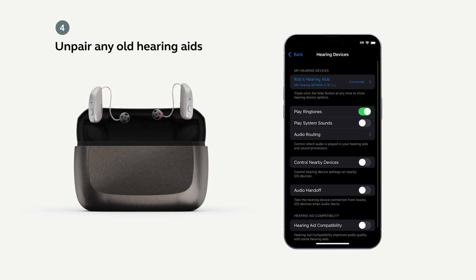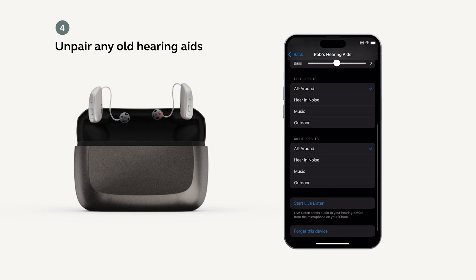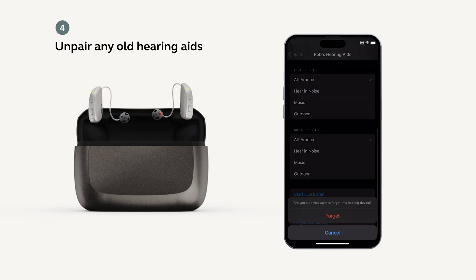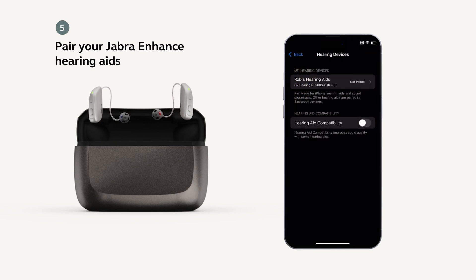To unpair, tap on the name of the device. Scroll down and tap on Forget this device, then tap Forget. The name of your hearing aids should appear as Your Name, Hearing Aids, Right plus Left.